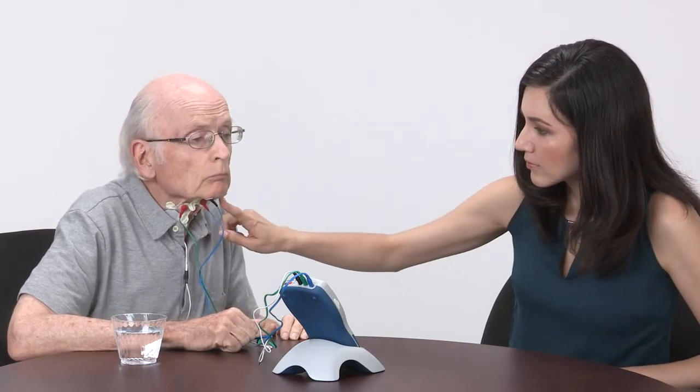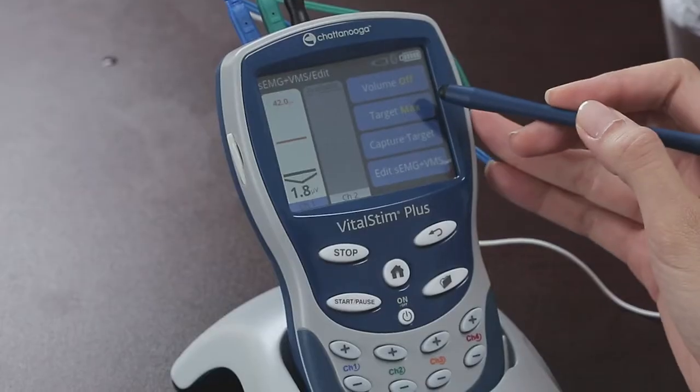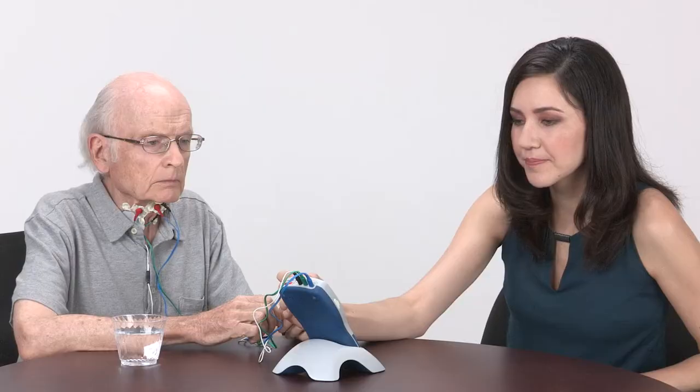This is where we want to focus the patient's attention. Channel 2 will be delivered to the thyrohyoid muscles. This is where the stimulation will be delivered. Next, we must capture the target level like we did before. So let's press capture max and do the same sequence as we have before in surface EMG biofeedback.